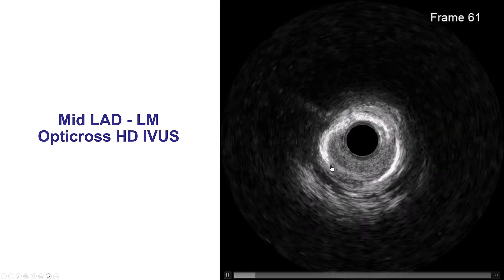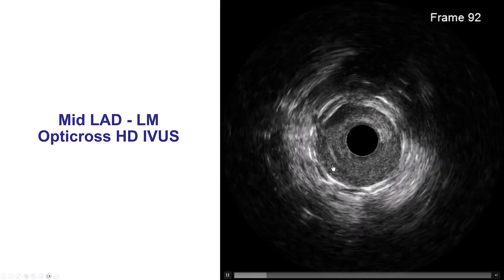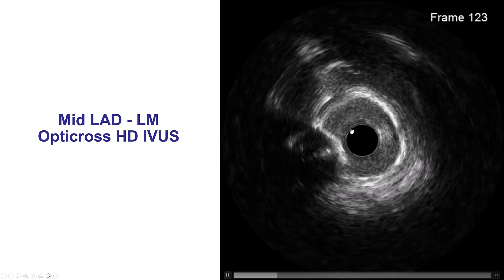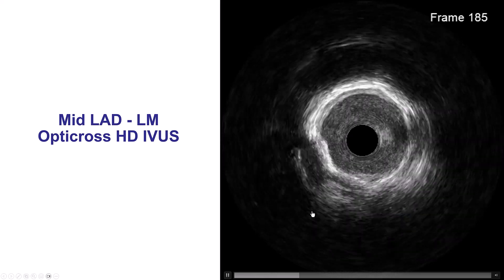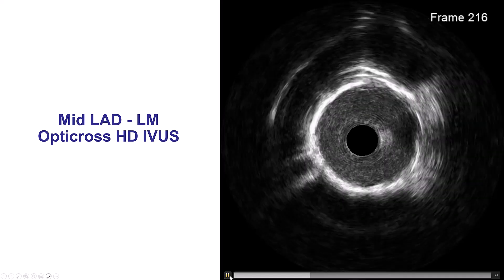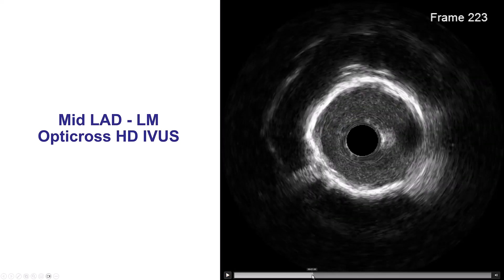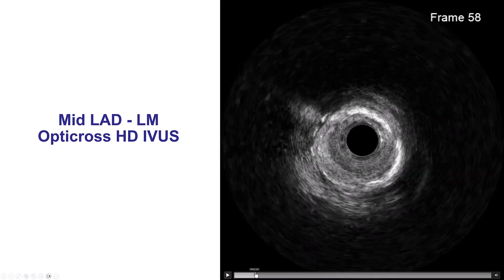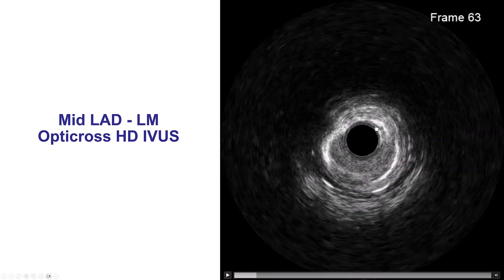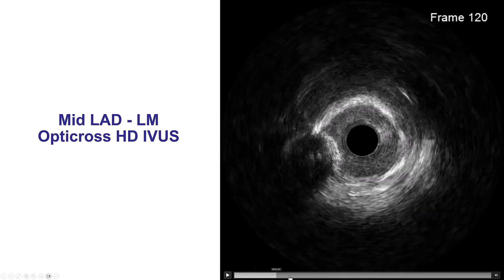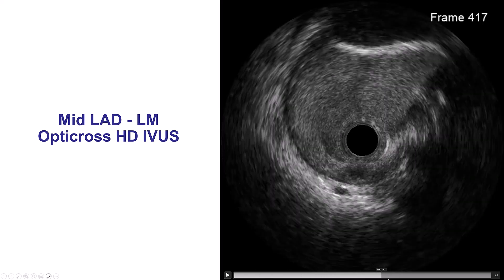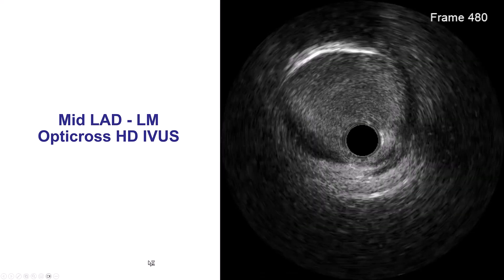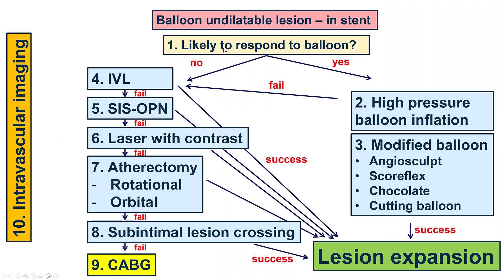And this is intravascular ultrasound. There are areas of underexpansion within the previous stent. The stent more proximally seems to be well expanded.